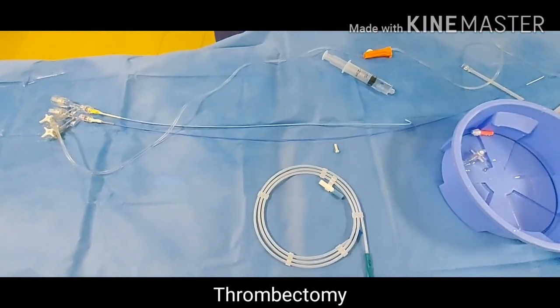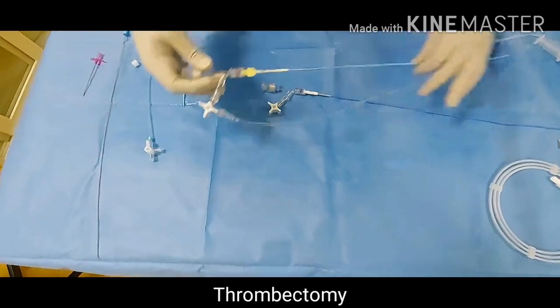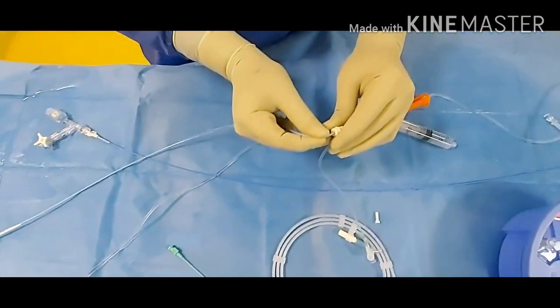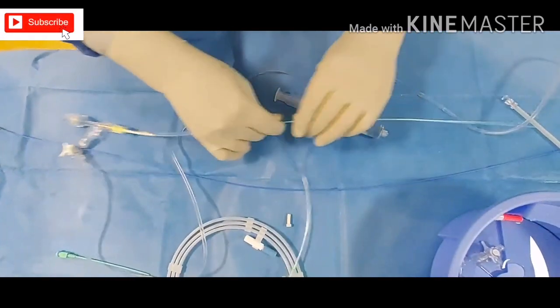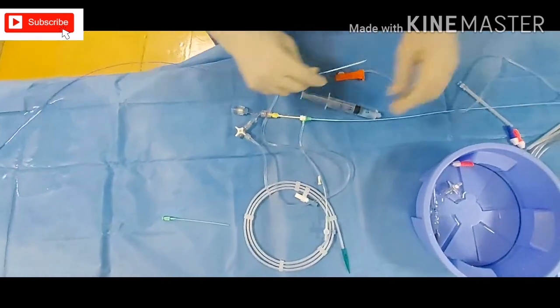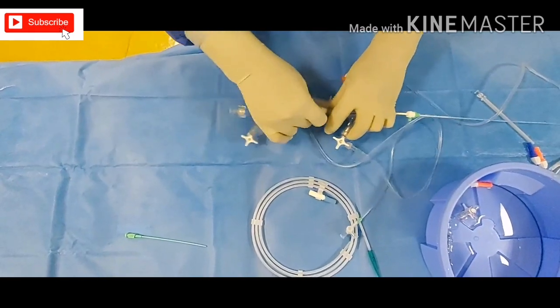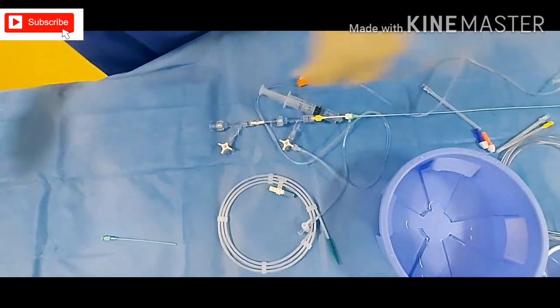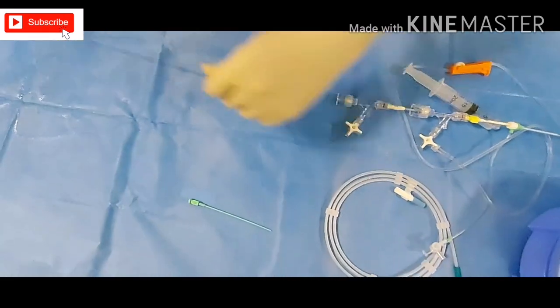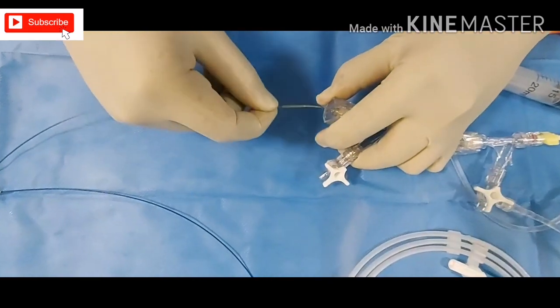The puncture needle, guide wire, and sheath will go inside the body. After the sheath is in, we remove the dilator — the doctor will do this part. Then our guiding catheter goes inside, followed by our sofia catheter inside. Once it is there, you should be ready with our micro catheter. The micro catheter will go inside through the Y-connector.